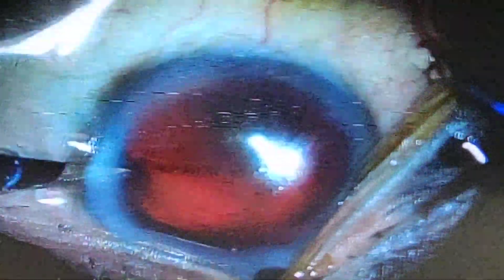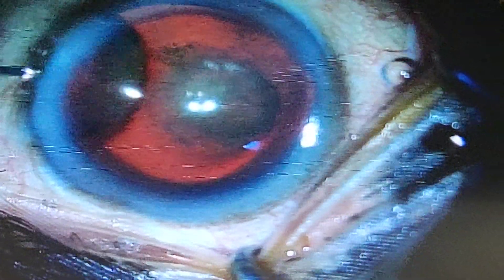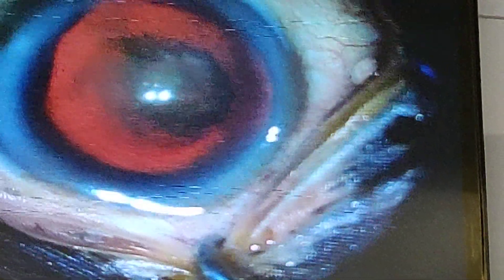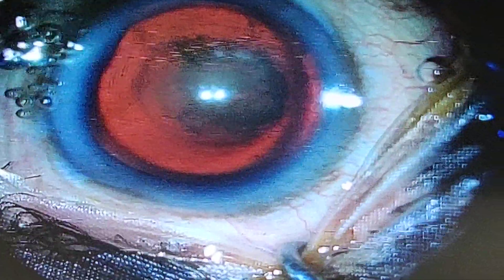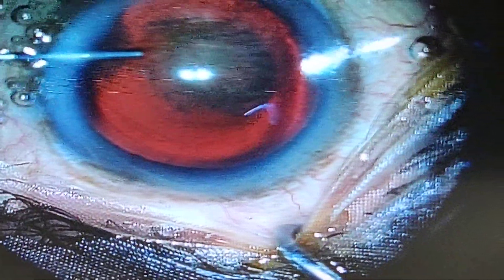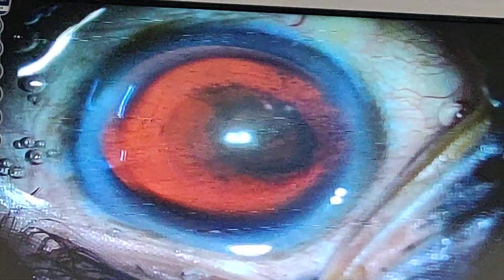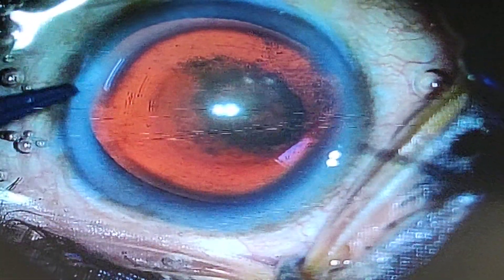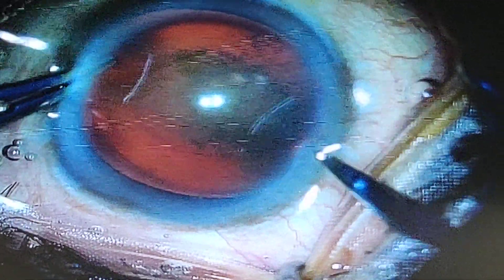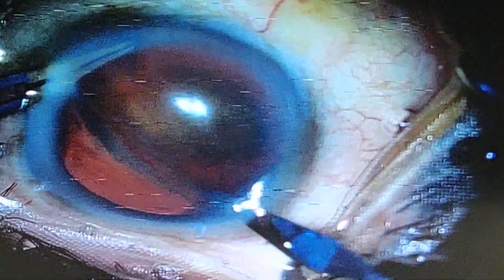This can be followed by injection of 2% preservative-free intracameral lignocaine, and now I am going to inject the viscoelastic. You can see the injection of chondroitin sulfate based ophthalmic viscoelastic. The advantage of this viscoelastic is that it protects the endothelium — it has a negative charge which binds to the positive charge of the endothelium.